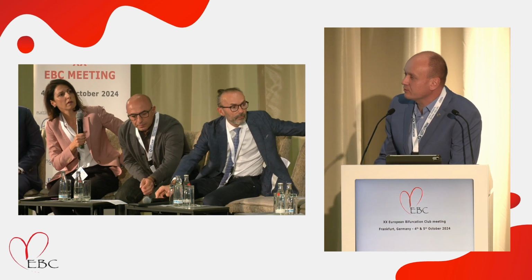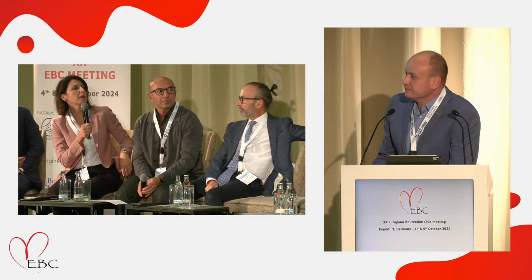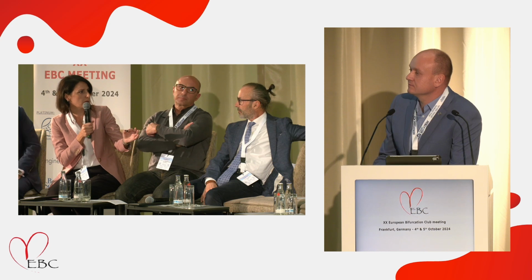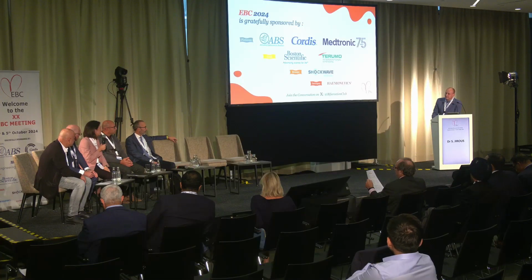Yes. But this is like a stenosis. Yeah, normal stenosis. There are 2 layers in left main and LAD, proximal part of LAD or ostium of LAD, but the result just after balloon was terrible. Okay, that's why, because sometimes you can finish with just one additional stent to convert to TAP, or to culotte, in such cases. But okay, you said the result wasn't satisfactory, and that's why you put an additional stent. Okay, yeah. I understand. Thanks.